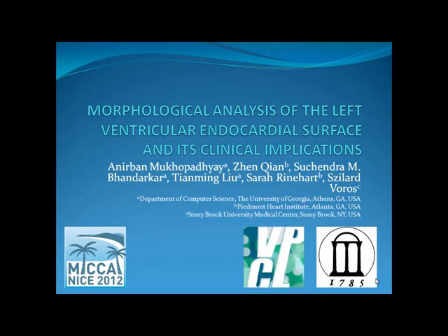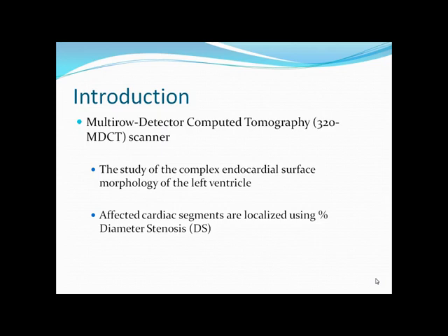Morphological changes of the left ventricular endocardial surface are studied in this paper using a bag of words approach. Recent development of the multi-detector CT has enabled the study of complex left ventricular endocardial surface morphology and meaningful localization of affected morphology with respect to the percentage diameter stenosis.